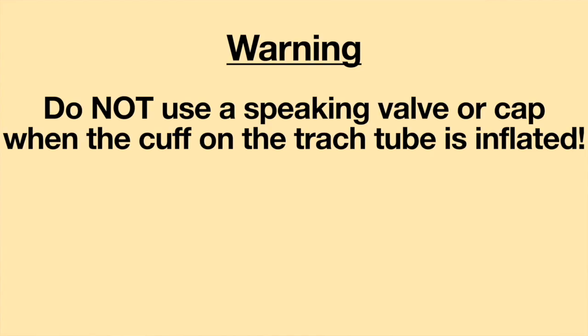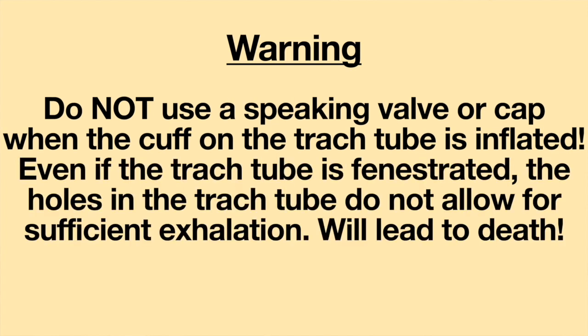It is important to make sure the patient has either a cuffless tracheostomy tube or that the cuff is fully deflated prior to using a speaking valve or capping the tracheostomy tube. Do not use a speaking valve or cap when the cuff on the tracheostomy tube is inflated. Even if the tracheostomy tube is fenestrated, the holes in the tracheostomy tube do not allow for sufficient exhalation. This will lead to death.